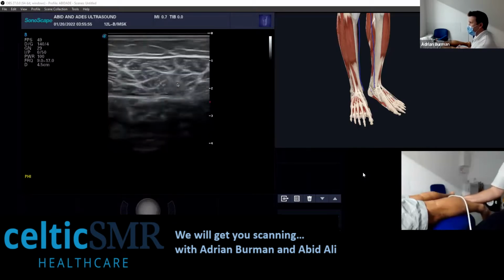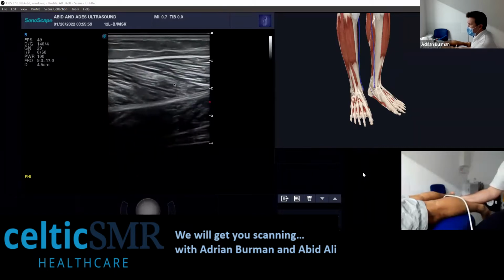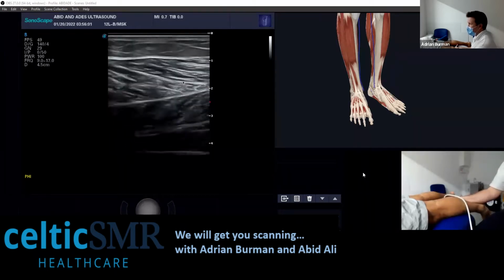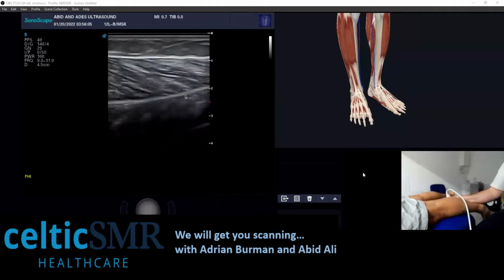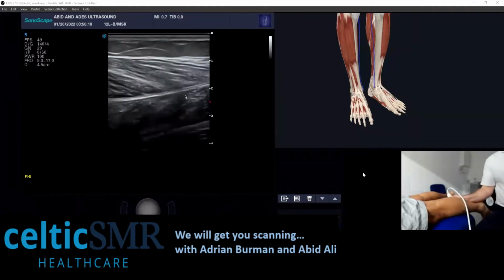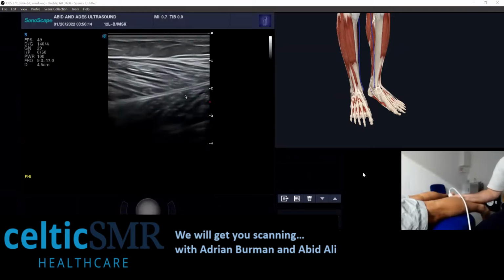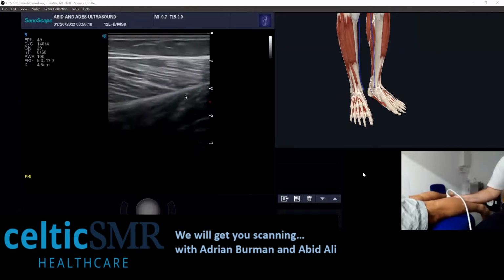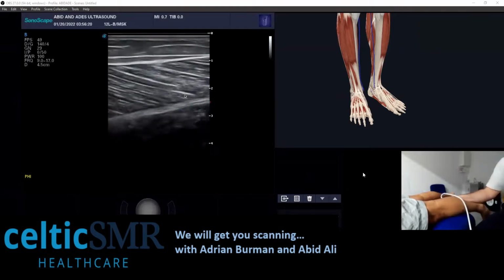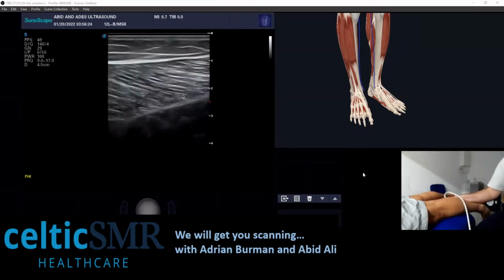I think that's what you're asking. If you turn to long section, you can see these fibers are nice. Yeah, it's knowing how much of it is too much, really, because when it comes to some of the injection therapy, having like hydrodissection applied to it with a sterile saline, which fiber would you address, what is classed as too thickened to go for, if that makes sense? Or would you correlate it purely to the site of pain?